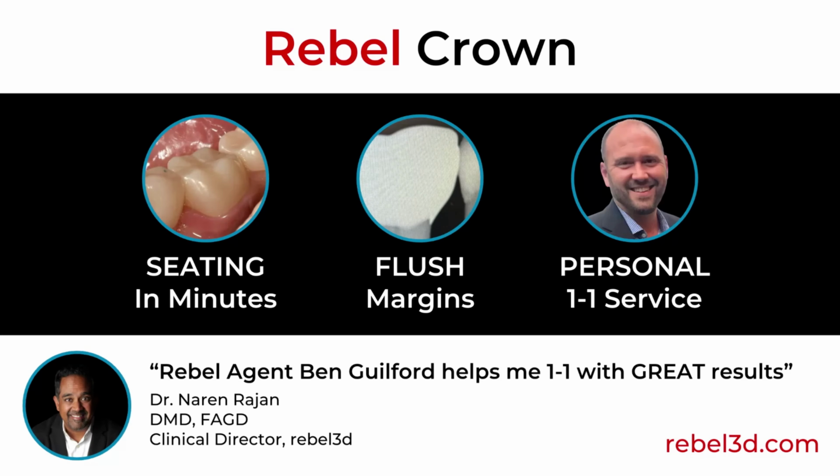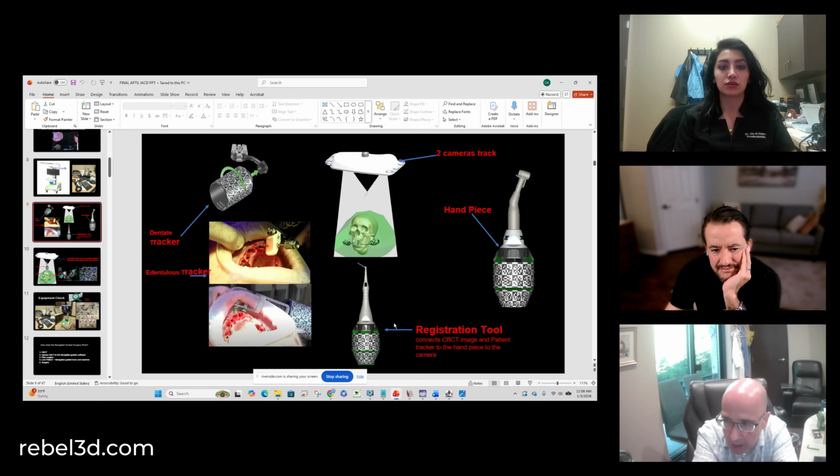My map to my driver to work together. That's through having some dots, pre-existing hard landmarks inside my map. It might be screws, it might be teeth, it might be whatever, to tell the satellite here that these are the landmarks that I have, to translate this positioning to my car.